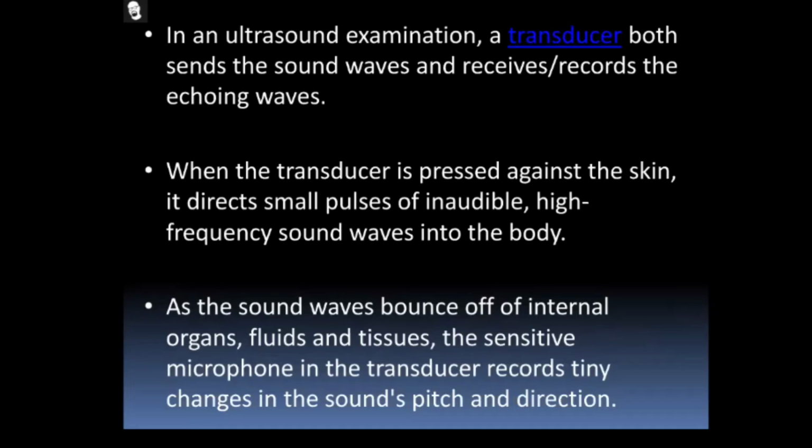When the transducer is pressed against the skin, it directs small pulses of inaudible sound. The most important thing is how much impression you give on the skin, and that is what determines the resolution. If you press over a particular region improperly, it will not give the right resolution. There is a normal range, a certain procedure for how to press the skin and what not to do, and you are supposed to follow that procedure for whichever area you scan.